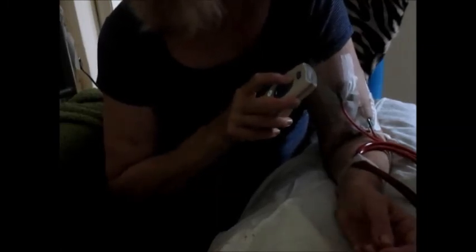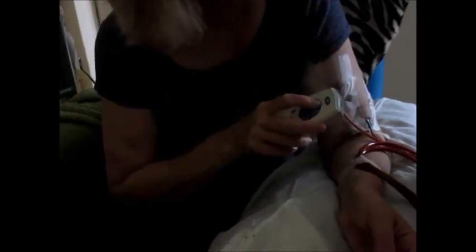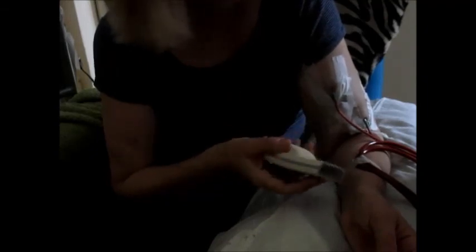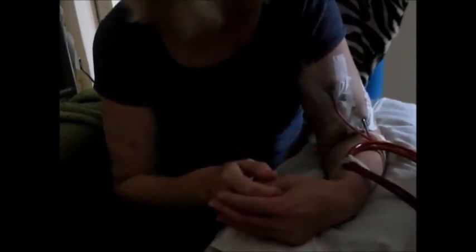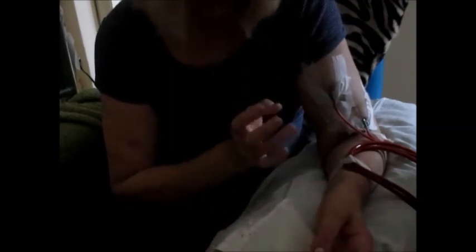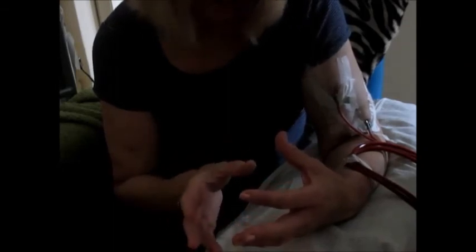I'm going to steadily increase my pump speed — my pump speed is around 350. People who have lines can usually only get up to a pump speed of about 300 per minute, which is one reason why NICE — the National Institute for Healthcare Excellence — recommends that all patients who are suitable should have fistula formation. They class it as the gold standard form of dialysis access. Lines should actually only be used as a temporary measure for emergency dialysis, or for those who have a live donor lined up or who have needed to start dialysis sooner rather than later.